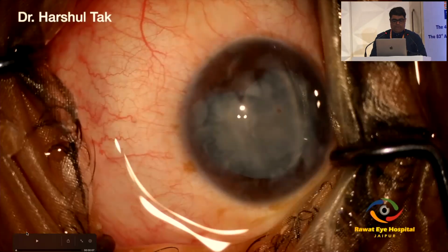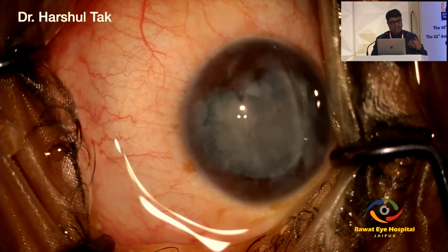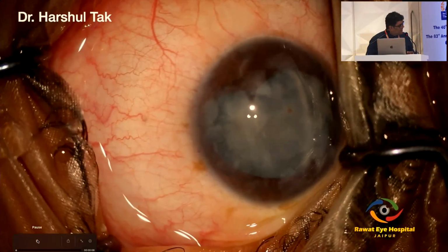But we know that the anterior capsule is ruptured, so we always have to counsel the patient that the PC may be ruptured. We may have to do posterior segment intervention. All the options have to be discussed with the patient. That is very crucial in a scenario like this, because once we go in and take out this fluffy cortical matter, only then do we come to know the status of the posterior capsule and whether vitreous is mixed with this cortical matter. So let's see how the case proceeds.